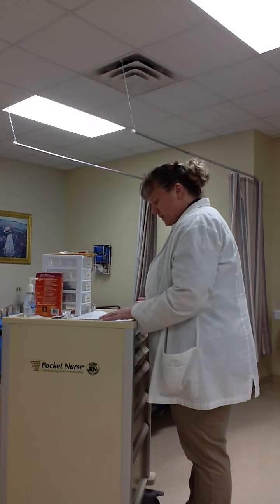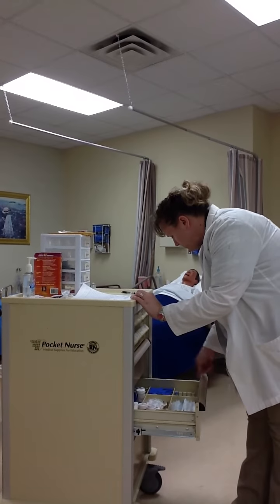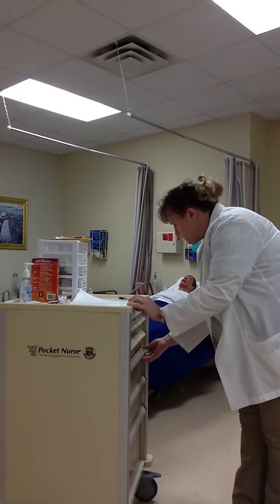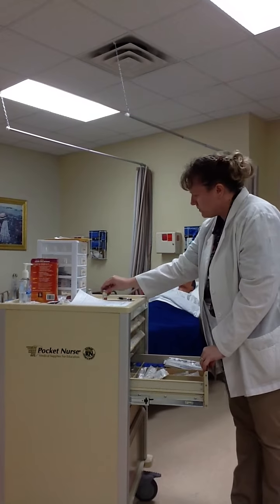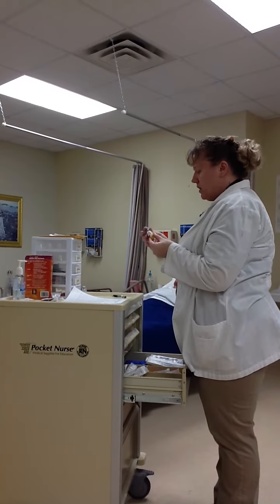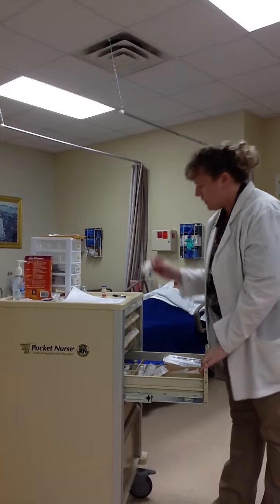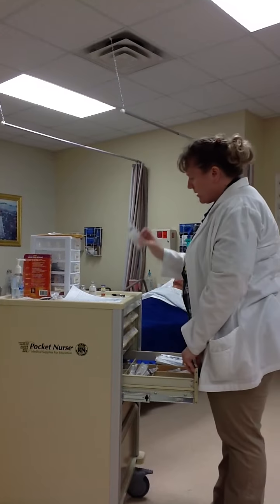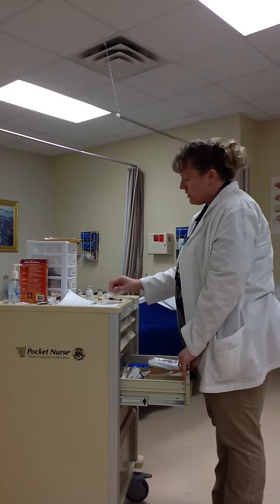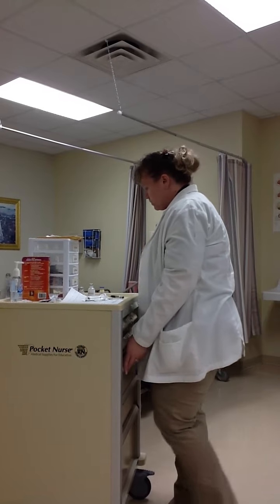My patient was having nausea, so I note now that I'm going to give some Phenergan. I have Phenergan. It is reconstitutable, so I note on this vial, when I look at it, it says that it is to be reconstituted with normal saline. So I know that I need to have normal saline, and I find my bottle with normal saline. I know that I will have to have something to draw my saline, so I make sure that I have a 10 ml syringe and a needle.